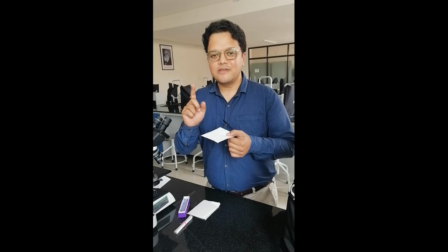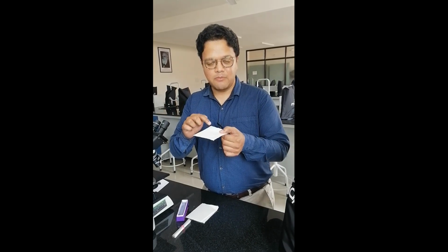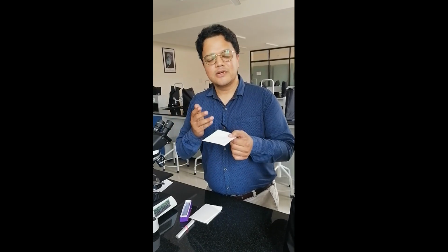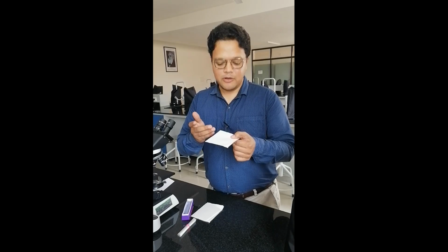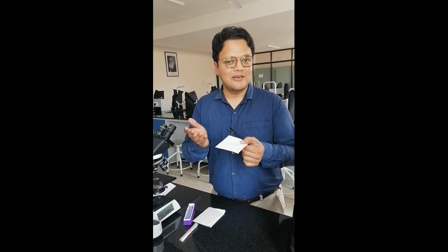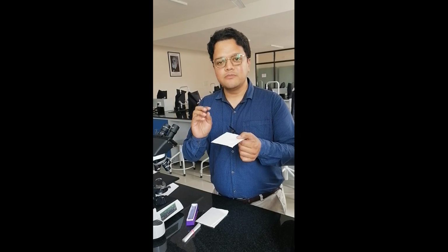Here also again we see many of you make a mistake, saying that whenever there's a last blood drop, you mark that and write that is the end. How can that be the end? Because if you mark that as the end, when the blood is present over there, it means you are still bleeding. So that is not the end. The end mark should be an empty circle. So this is another common mistake you make in bleeding time.